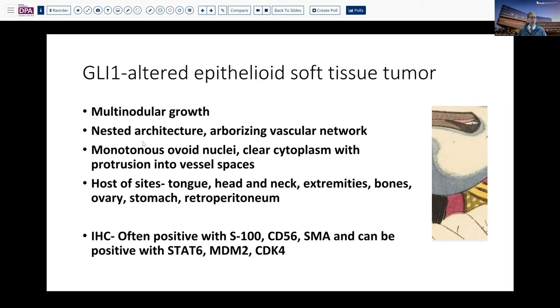Interestingly, these tumors tend to have multinodular growth, somewhat nested architecture, the arborizing vascular network that we saw with our case, but they tend to be rather monotonous and have very oval nuclei, clear cytoplasm with vacuoles, intravascular protrusion, and a periendothelial growth pattern. They tend to be predominantly found in the head and neck, especially the tongue, but can be found in extremities, bones, and other sites. These tumors are often positive with S100 — which ours was not — and CD56 — which ours was not. However, because multiple genes can be amplified, you can also see STAT6, MDM2, and CDK4 in these lesions.